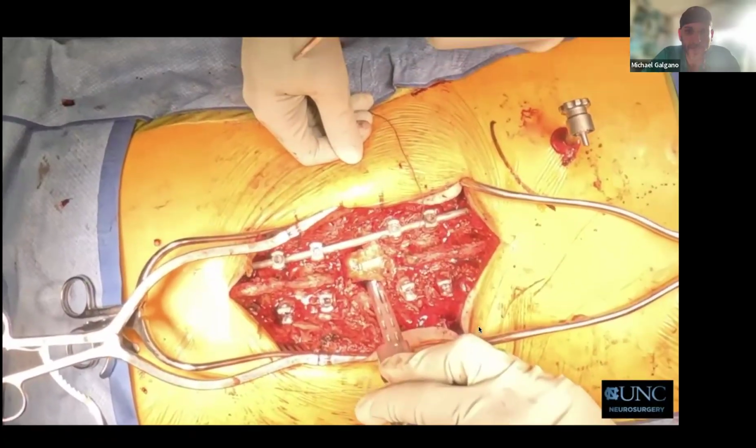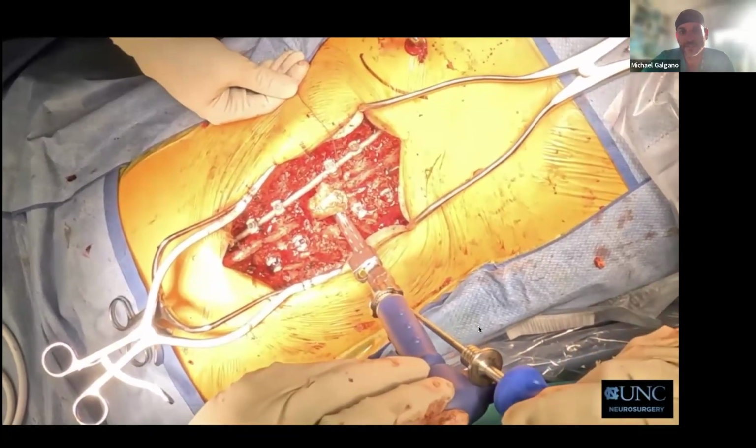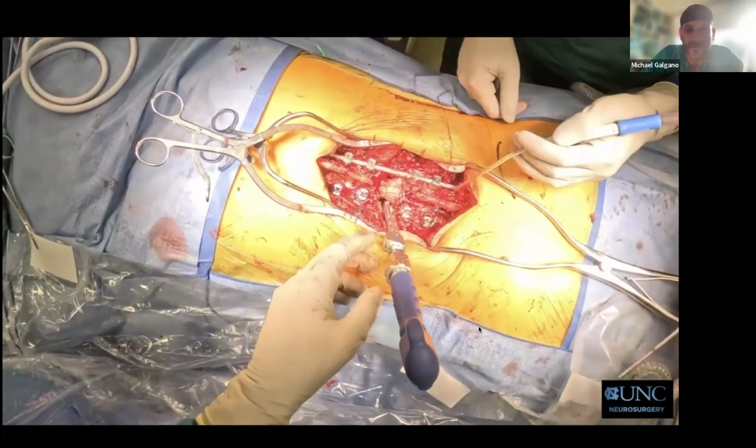And then at that point, we provisionally tighten the cage so that it stays in an expanded position, which is what we're doing here. We bring fluoroscopy in, and then we can make sure that the end caps of the cages are matching the end plates of the vertebral bodies above and below.